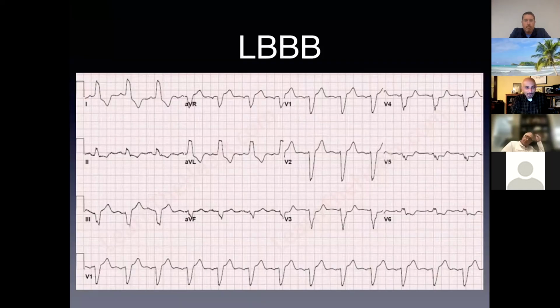Here's another left bundle. Make you think, hey, well, are these ST segments up? And if a patient's having chest pain, it can be very hard to tell the difference.